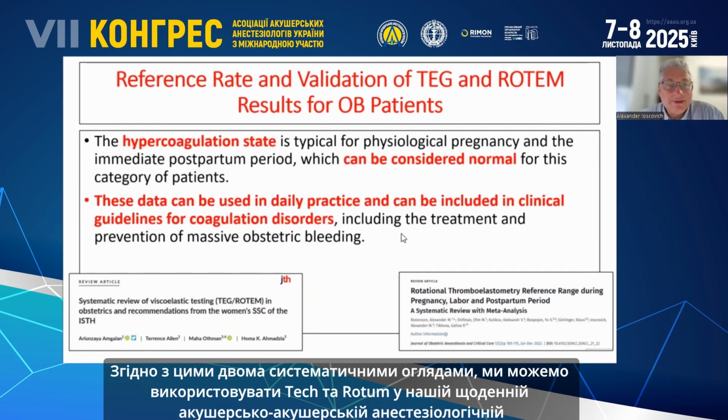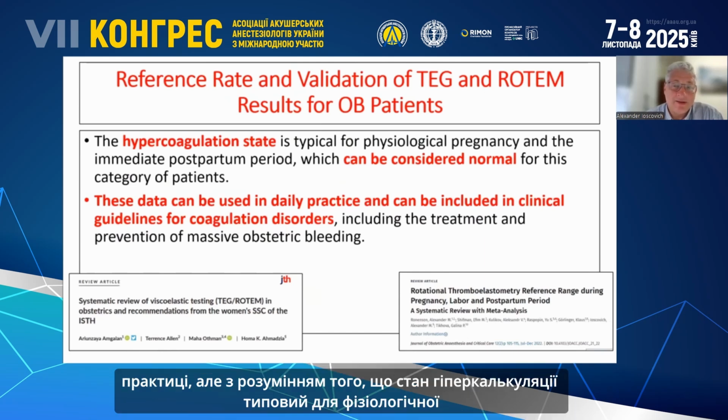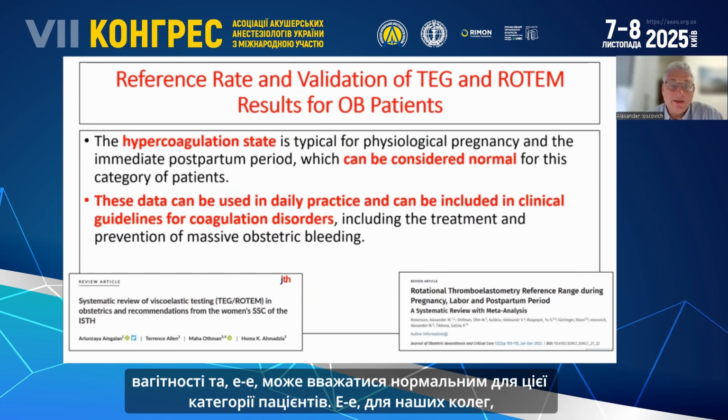Okay, according to these two systematic reviews, we can use TEG and ROTEM in our OB anesthesia daily practice, but with the understanding that a hypercoagulation state is typical for physiological pregnancy and can be considered normal for this category of patient.